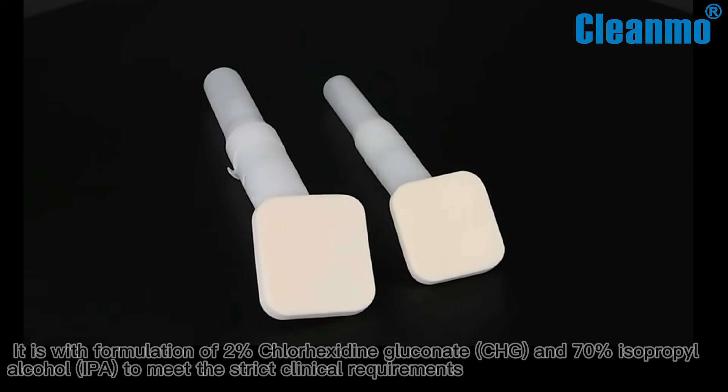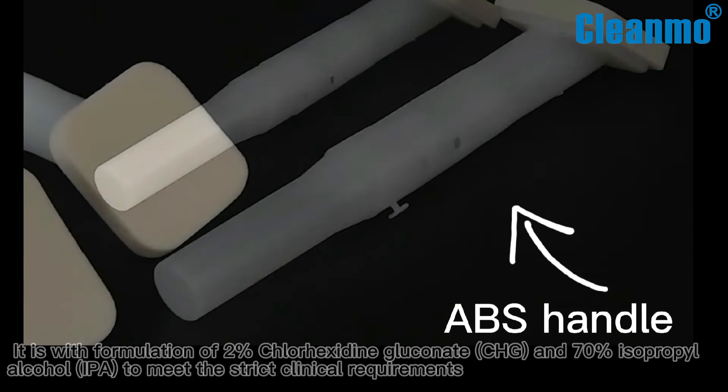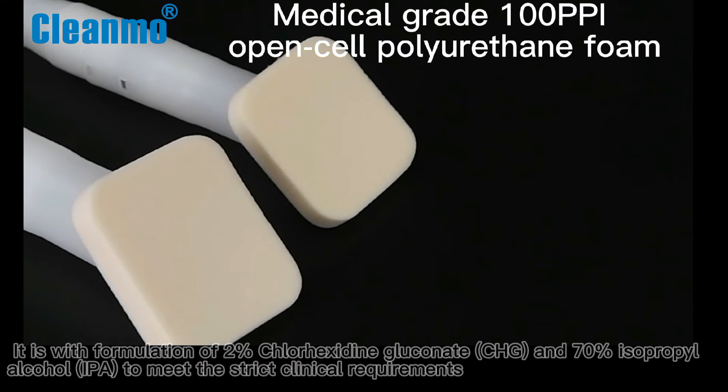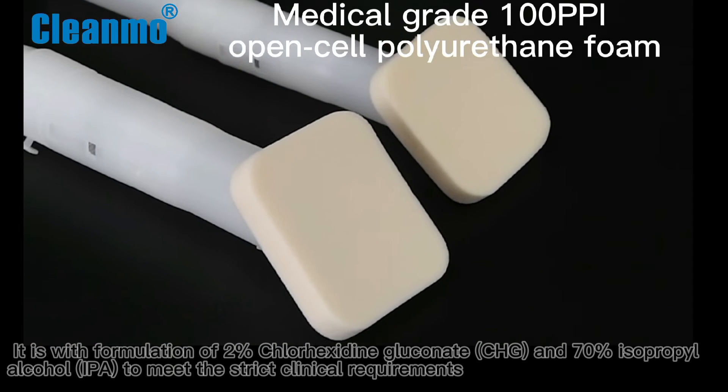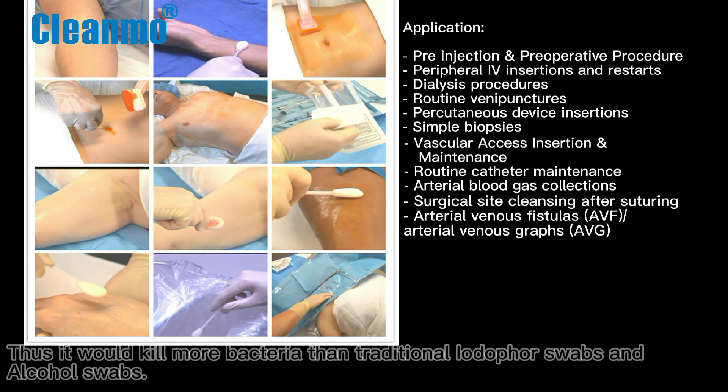It features a formulation of 2% chlorhexidine gluconate (CHG) and 70% isopropyl alcohol (IPA) to meet strict clinical requirements. Thus it kills more bacteria than traditional iodine swabs and alcohol swabs.